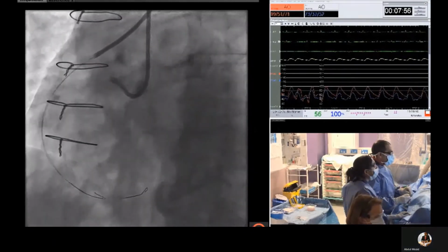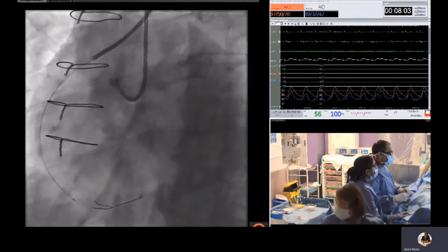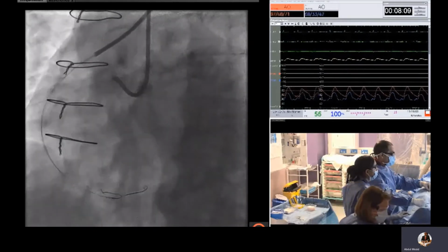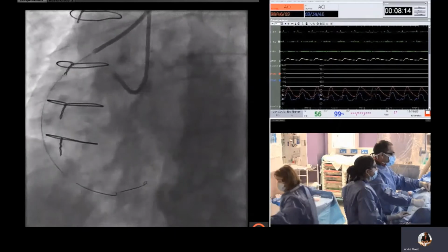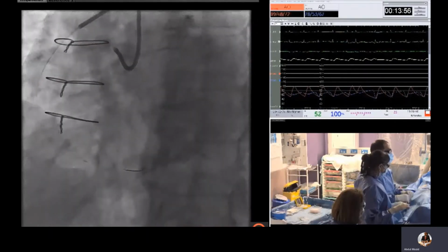So we went straight for a retrograde approach to recanalize the mid RCA. This was a retrograde Mamba Flex 150 microcatheter, and you can see here, initially with a Sion Black wire, because of the acuity of the angle, the microcatheter and the wire prolapse.